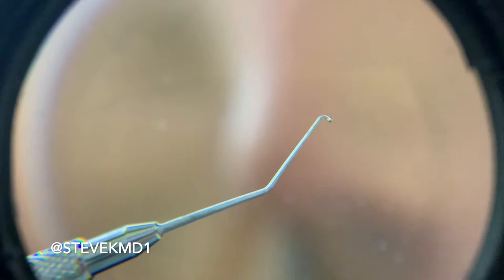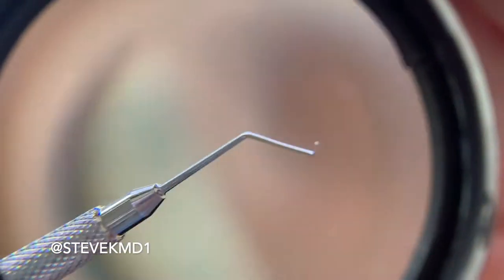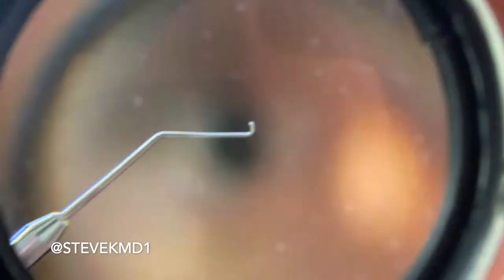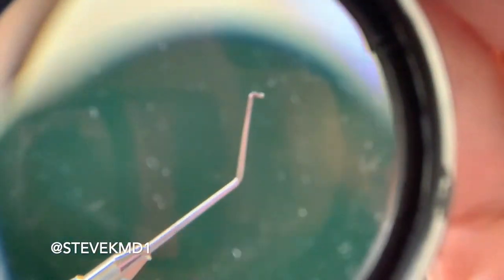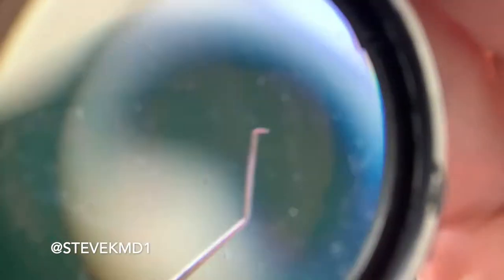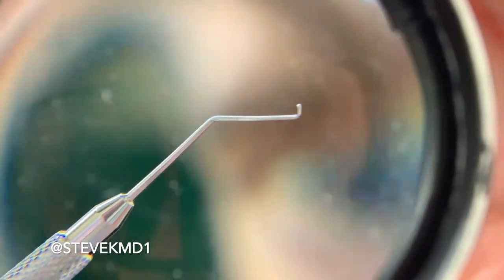Then the very next thing we use after that is what we call a second instrument. There's going to be some variability, but it's got a little end on it, kind of like a hook — and the very tip can vary depending on the surgeon's preference, but that hook has a little ball in this case. They call it the second instrument really because you use it in your second hand. Your primary hand has the main handpiece that removes the cataract, and this is used to kind of break up the cataract.